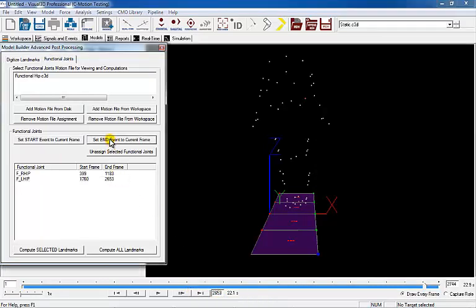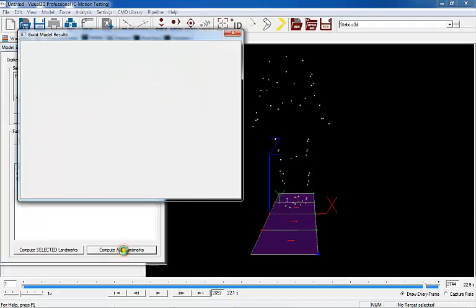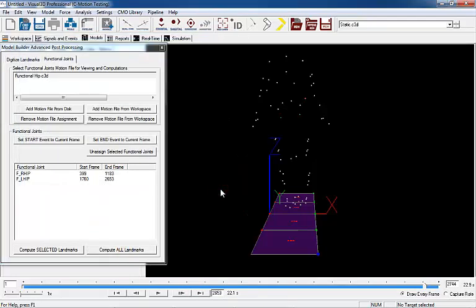Once a frame number appears for all the start and end frames of the functional joints, select Compute All Landmarks and close the dialog box.